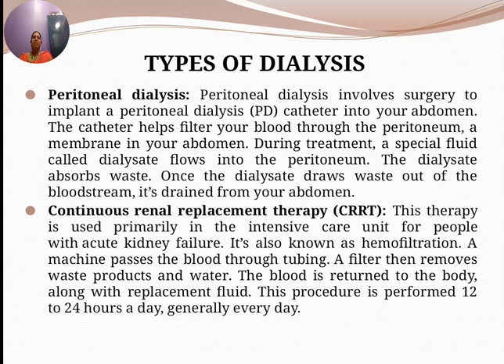Then the third method is continuous renal replacement therapy. This therapy is used primarily in the intensive care unit for people with acute kidney failure. It is also known as hemofiltration.